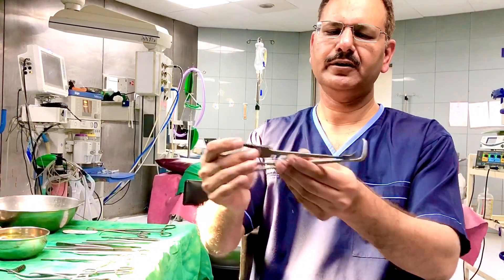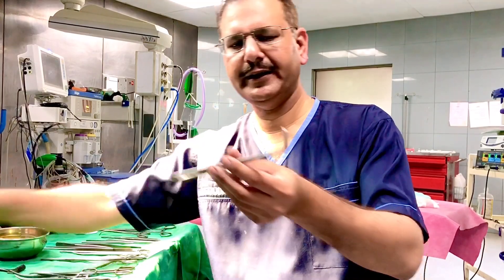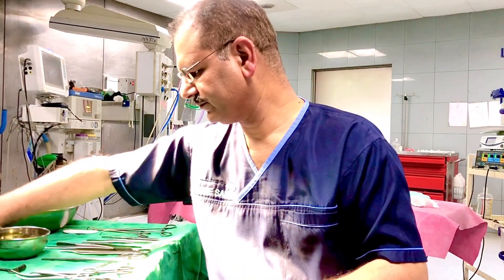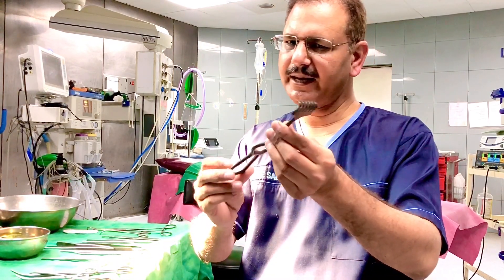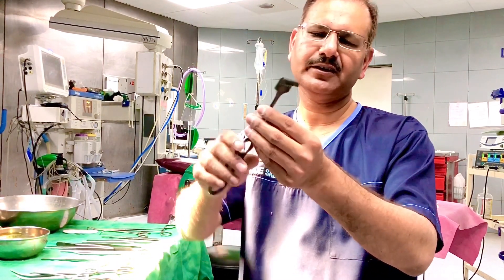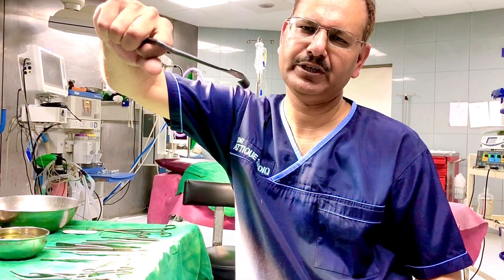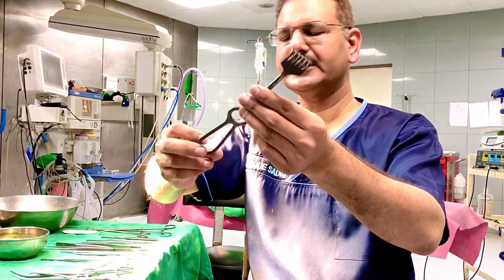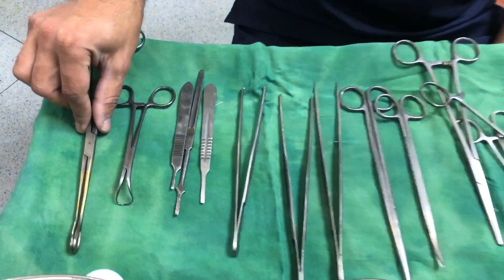These are small right angle retractors. This one looks like a cat's paw — that is why it is called a cat's paw retractor. It is used to retract skin and subcutaneous tissue and is mostly used in plastic surgery.